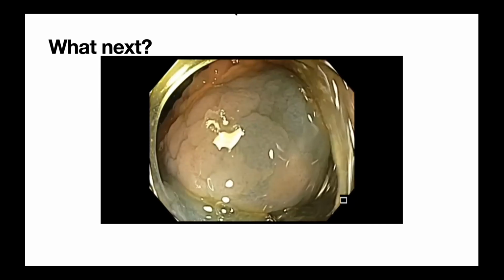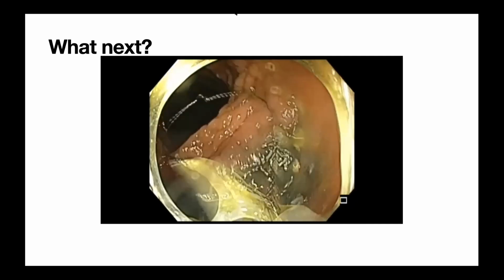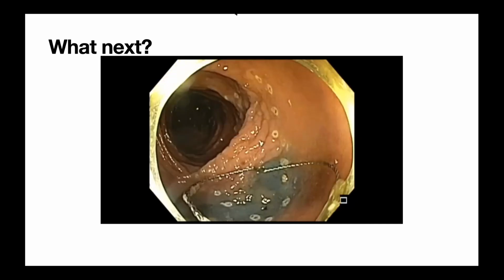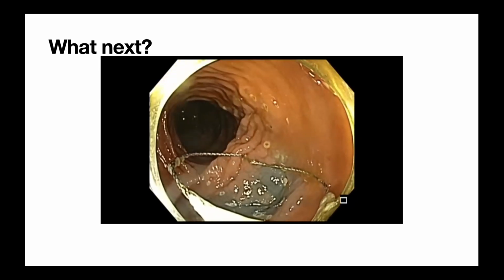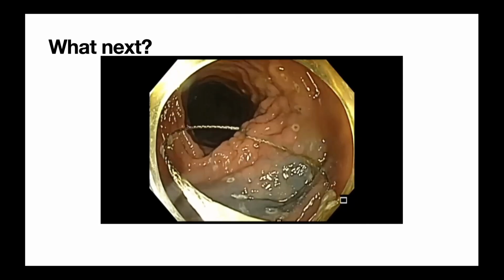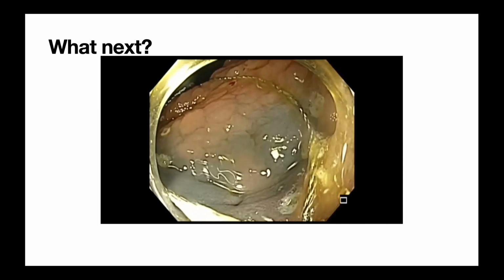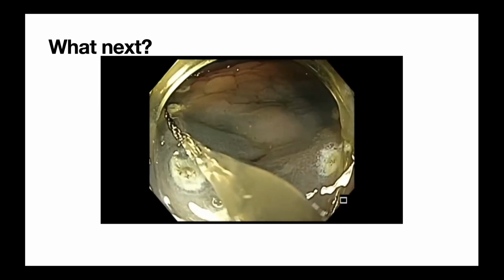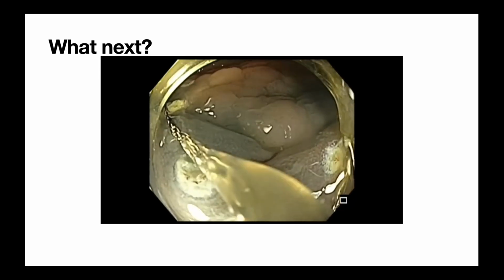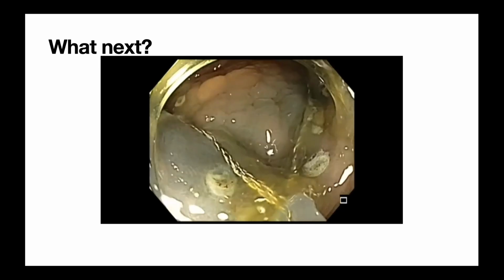We are going to look at it. I wanted to share with you here. The first lesion in the cecum that was resected many years ago was an SSA. No, it was said to be tubular. Yeah, but they made a mistake. You can go back. Endoscopically, it was an SSA. I can tell you that. Okay, all right. So can you try to go back and then let us know?